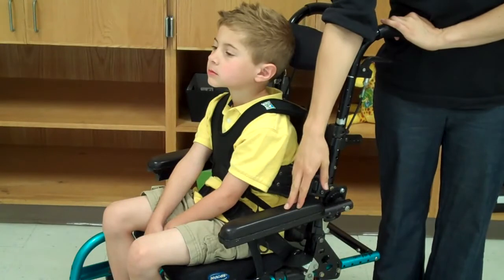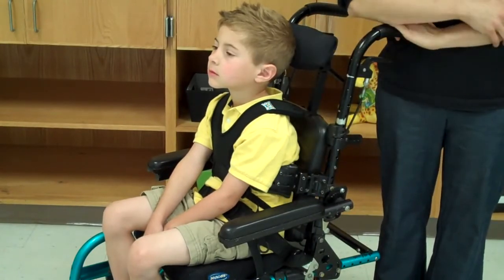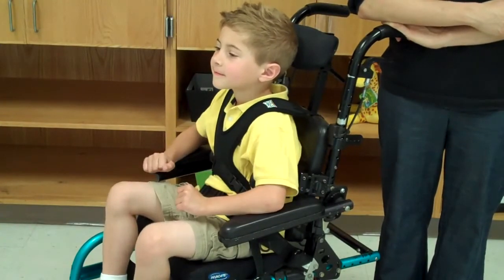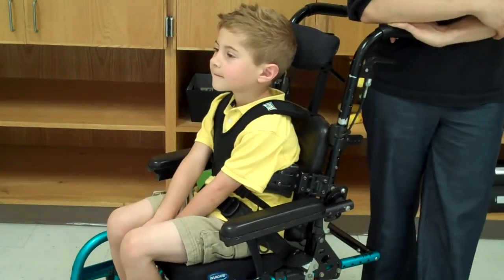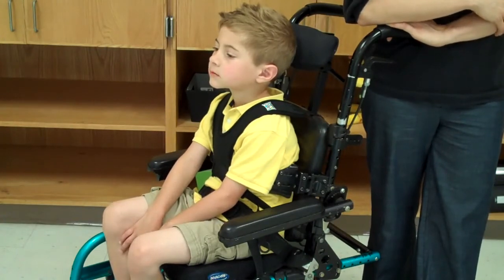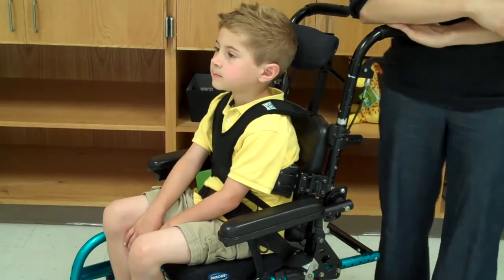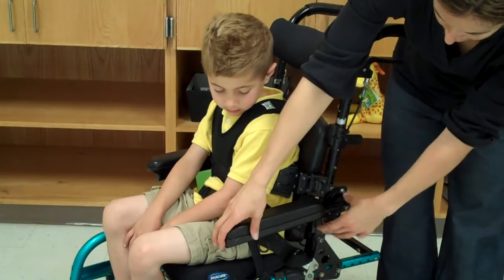This is the armrest. The armrest on a wheelchair can also assist the student with sitting upright by providing a weight-bearing surface. They can be used during transfers, and students who are able to can push up on the armrest to reposition their hips back in the wheelchair seat. Lap trays are typically secured to the armrest as well. Some armrests can be flipped up and moved out of the way when pushing a student up to the desk so that the wheelchair fits underneath the desk.